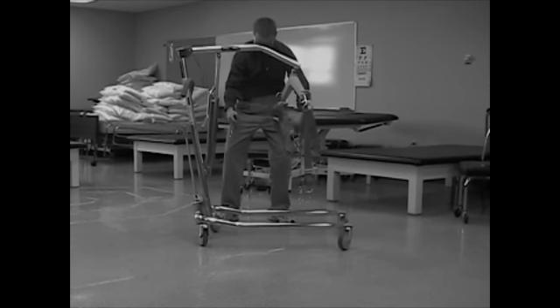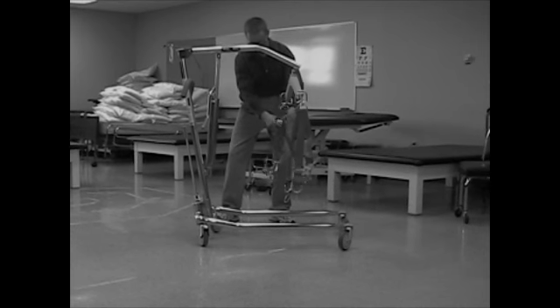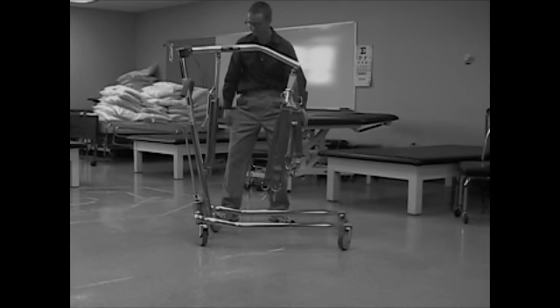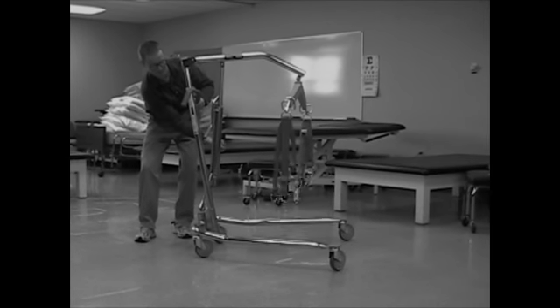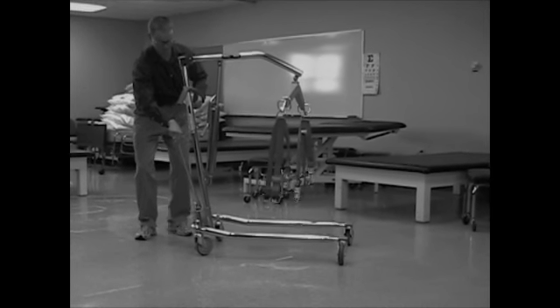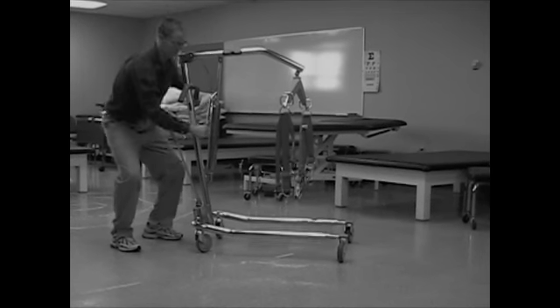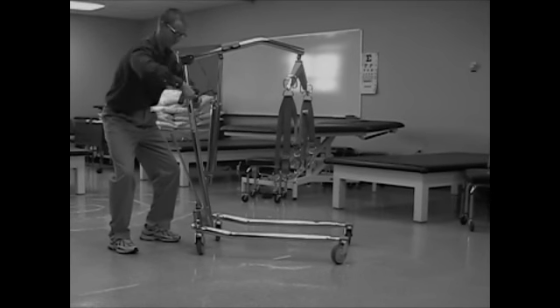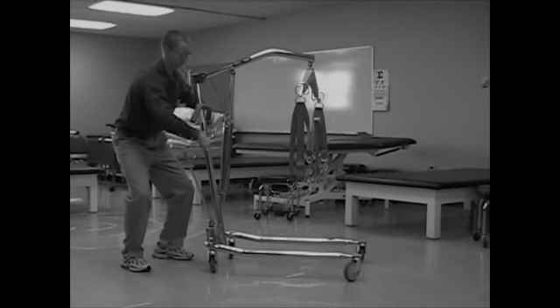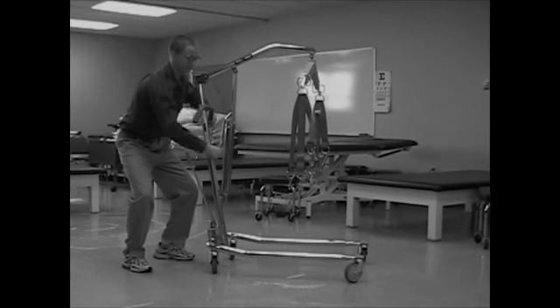Well, those right there, Mr. Pomperbottom, are the chains you'll use to attach to the sling. And that's the lever for adjusting the base width. Well done, Mr. Pomperbottom. That right there is the pump. That hydraulic pump will help you lift the patient with ease — much like using a water pump, wouldn't you say, Mr. Pomperbottom?